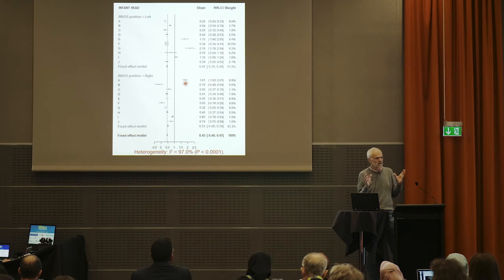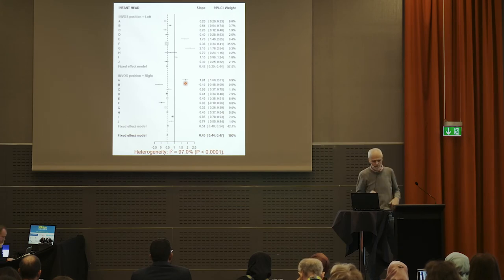And that's a little, we know that there is different. If you sort of move the sensor, you get different values, and sometimes you happen to get a very different value. Okay, this is a baseline problem.